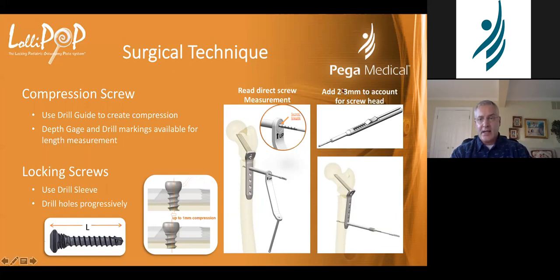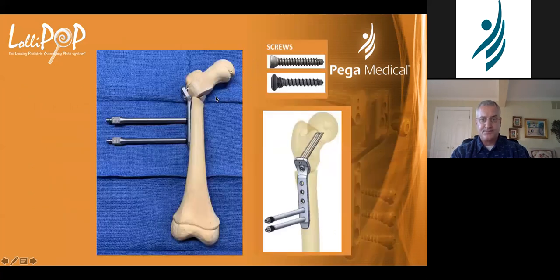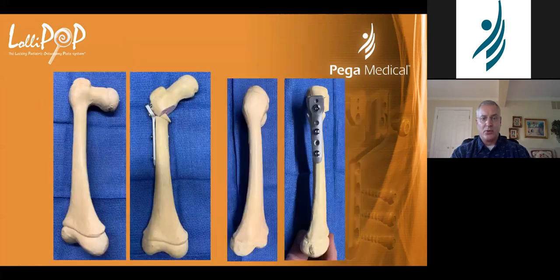You do want to add a couple millimeters onto your measurements just because of the heads. This is where we are with our bone model. We have now got it to the point where we have our plate in place and we have our drill on. We reduce it under fluoro. It looks good. We go ahead and fill up the holes.